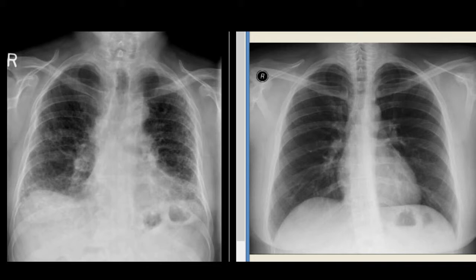Both right and left main bronchi are also dilated and irregular in shape. Looking at the left main bronchus, there is no gradual tapering as would be the case with a normal bronchus — the appearance is suggestive of traction bronchiectasis. Both right and left pulmonary arteries have lost their definition. Looking at the mediastinum, it is not only widened but there is also architectural distortion.